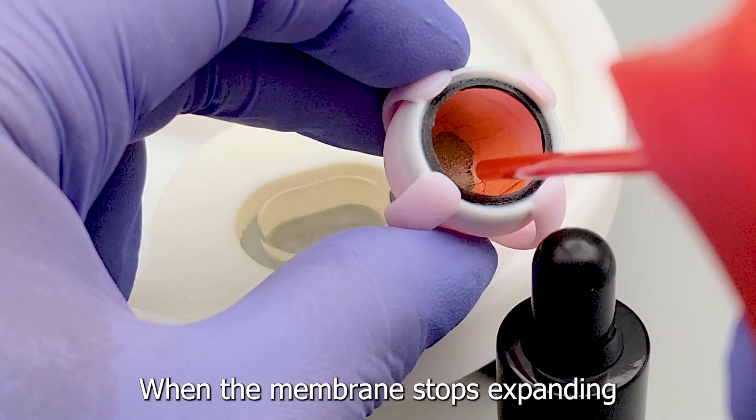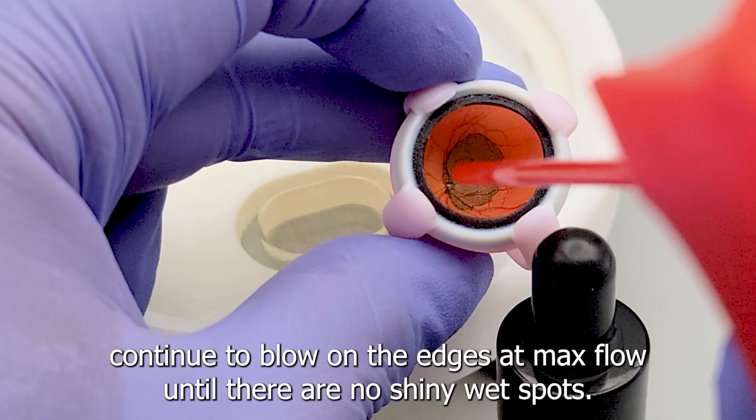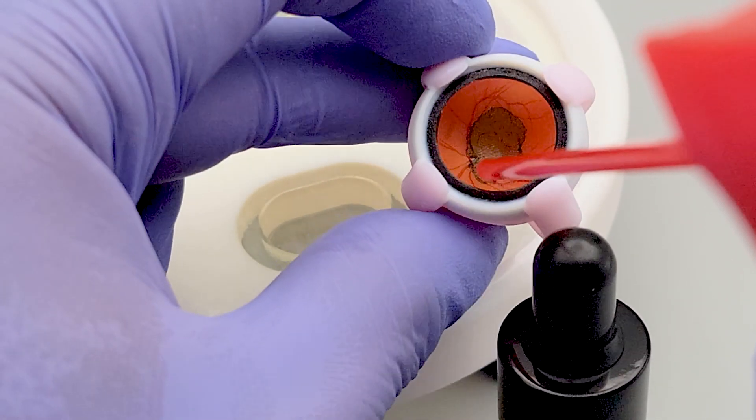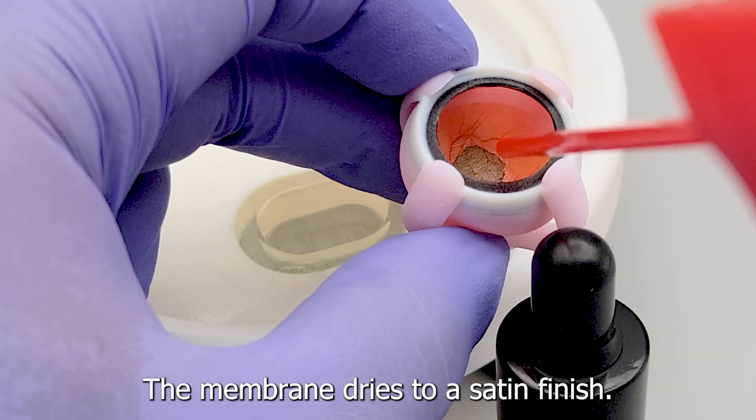When the membrane stops expanding, continue to blow on the edges at max flow until there are no shiny wet spots. The membrane dries to a satin finish.